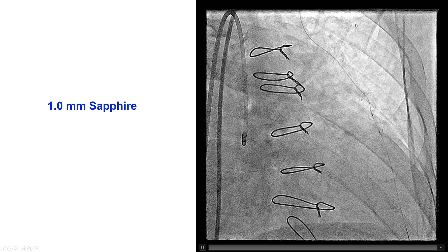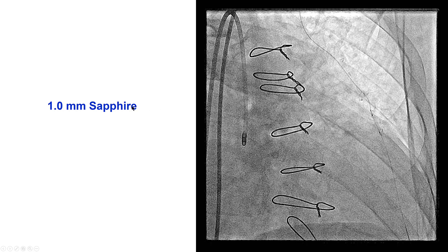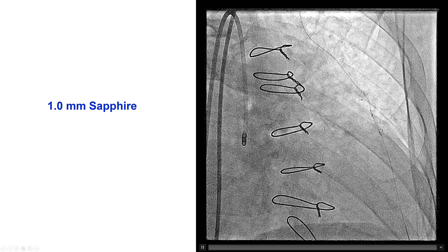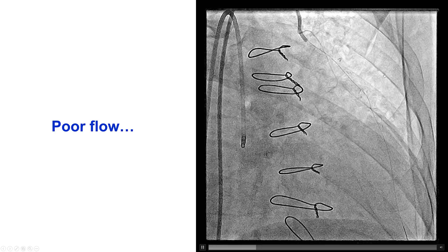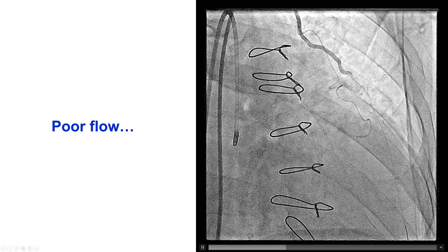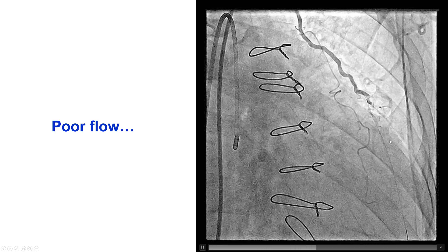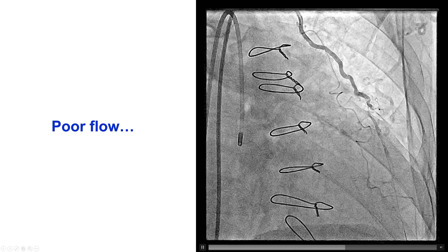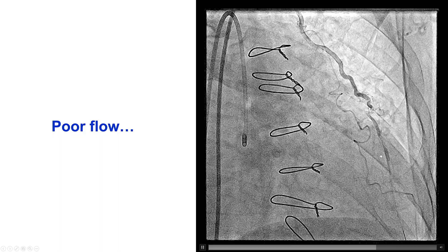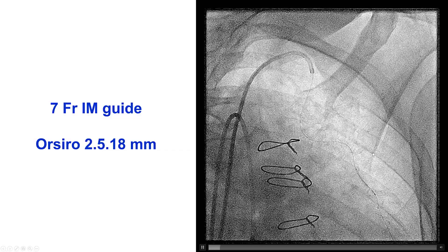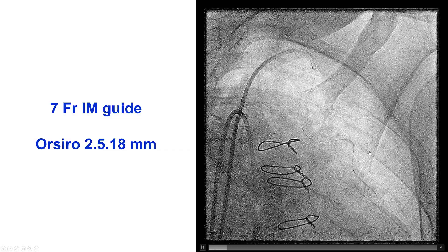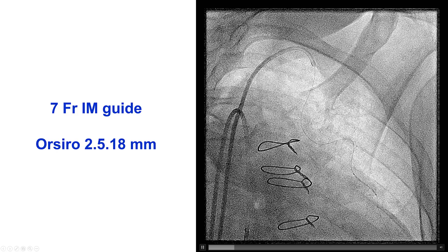We were able to advance a 1.0 mm sapphire balloon, which is our go-to for challenging delivery lesions. That delivered well, and then a 2.0 balloon after that. We continued to have poor flow down the LAD, and now we decided to try to deliver a stent.